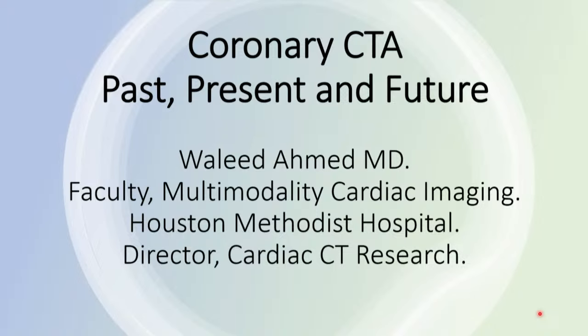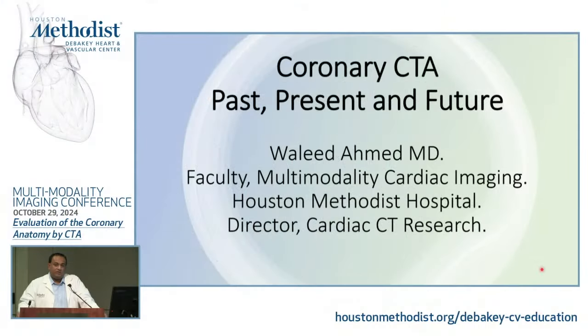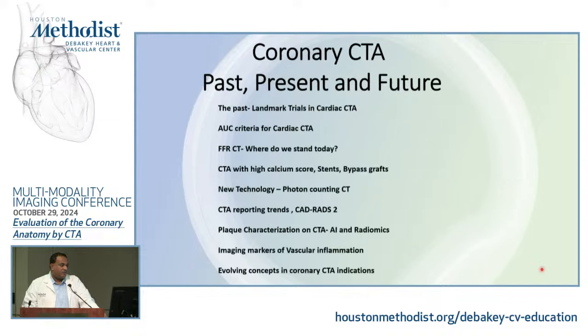So the past, we're going to go over some landmark trials in cardiac CT. We will go over where the technology stands at present, and then very exciting future developments in coronary CT that I will talk about in the later part of my talk. I have no disclosures.